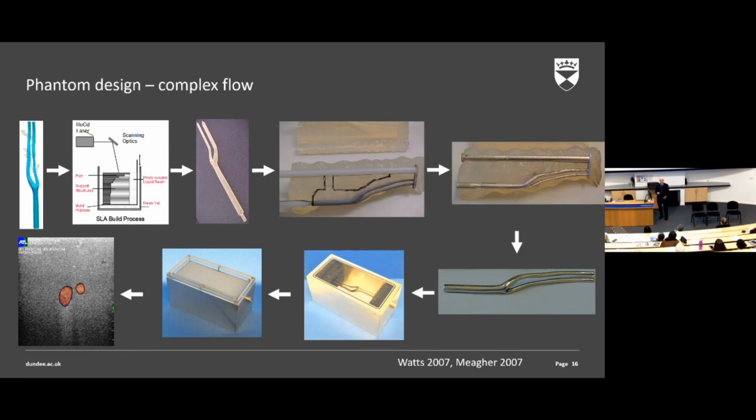So the next step would be to take a 3D printer and to directly 3D print all of this, but this still remains the domain of research, really.